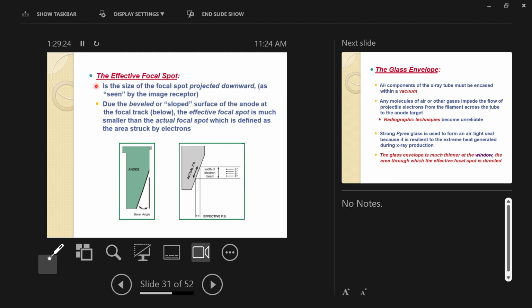So you're laying on the table looking up at the X-ray tube. How big does the focal spot appear to you, right? Like this pen has a width. If I hold it like that, there's the width of the pen. But if I turn this pen, it doesn't look quite as long. And here's the other thing, right? Over on this side of the room, over there, right? The pen looks very small to you. It's very narrow because I'm pointing the pen directly at you, right?